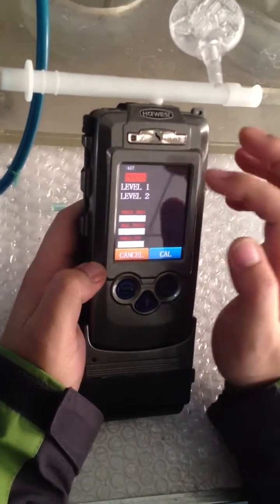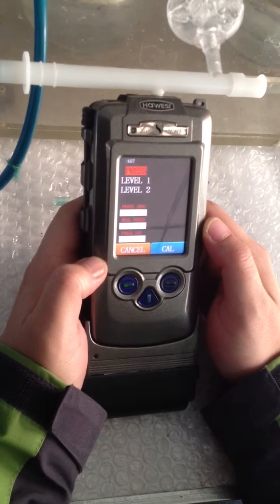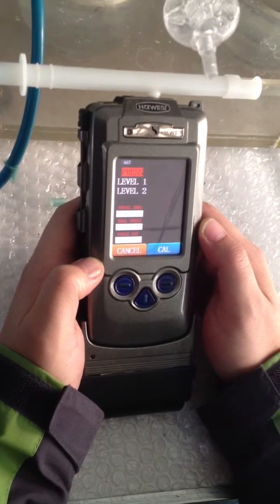There are three options: Press, Level 1, and Level 2. Press is actually for pressure calibration. Level 1 and Level 2 are for the alcohol calibration.